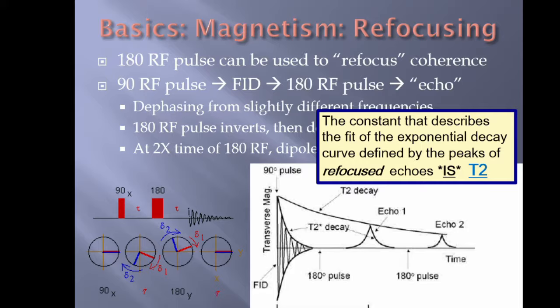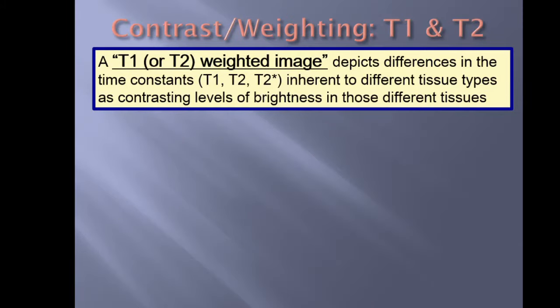We've been over the inversion pulse. If you use inversion pulses, things decay as T2. If you don't use the inversion pulse, it's T2 star. Okay, sorry. Rapid review.